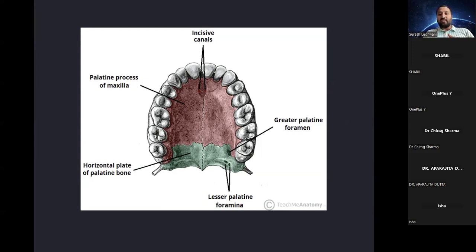The important vital structures over here are the greater palatine foramen and the lesser palatine foramen. Would you say they come in our path while placing the pterygoid implants? No, they don't. But what if you have that day when your pterygoid implant doesn't hit the site where you want? Then when it is going towards the lateropalatal side, it might hit these vessels. So you need to be aware of these vessels.